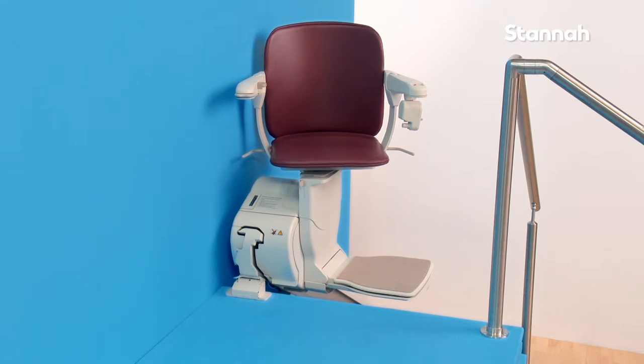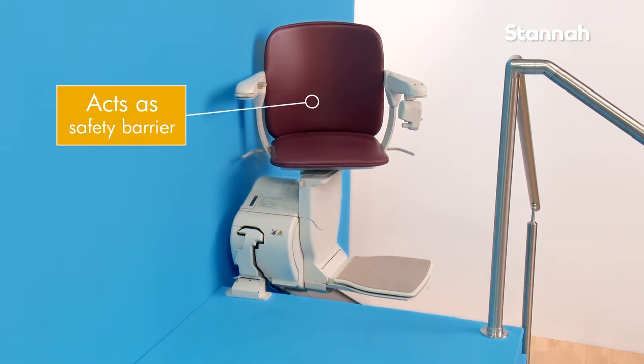If the stair lift is left in the swiveled position, it can act as a barrier across the top of the stairs, making the stairs safer.